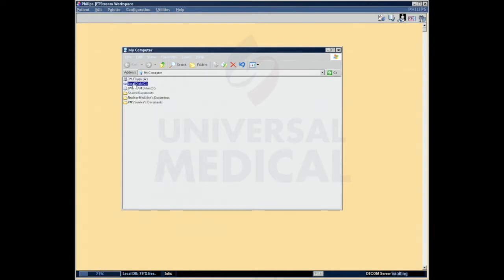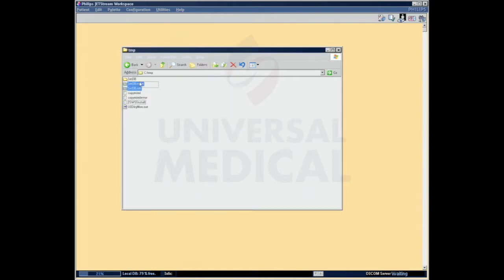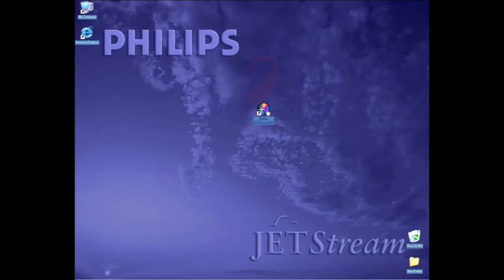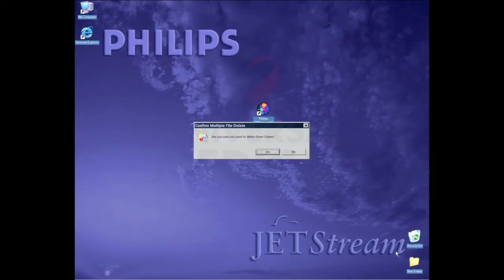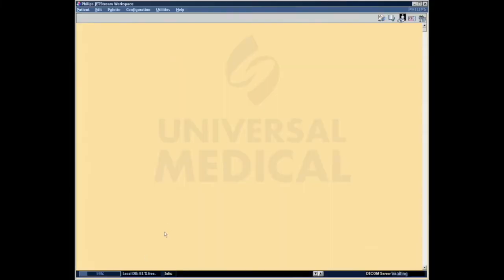Another way I can prove this is I created a temporary space filler that is about a gigabyte. If I delete that, and if I delete some other junk files up here that I have, what we shall see is when I start my JetStream application back up, oh, I should have emptied it. Empty the recycle bin, because until things are truly deleted, they're still utilizing drive space. Okay, so they're deleted, and now I'm down to 19% utilized. I did not change any of the patients.